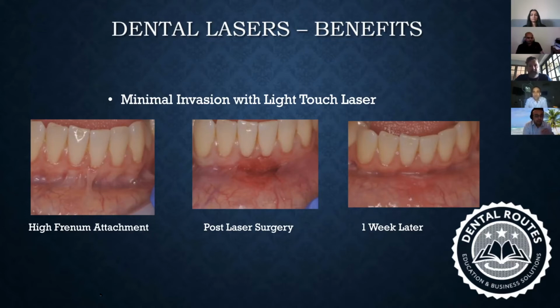So in this, are you happy to take a couple of questions at this stage? Yeah, yeah. We got a question from Darshan. Hi, Darshan. Hello. How does the clinical healing show differences when using a surgical bur or a scalpel as compared to a laser?